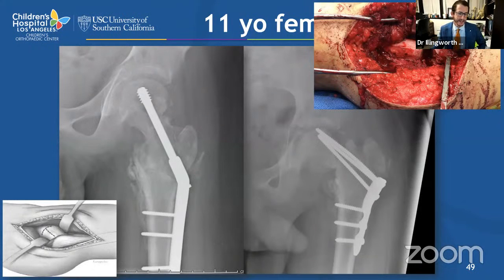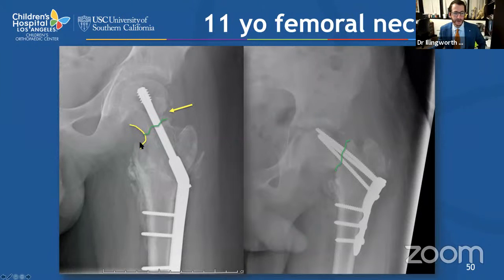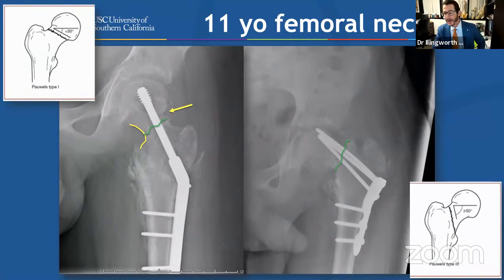You can see that we obtained anatomic reduction along the medial calcar of the neck over here, but certainly where you see the arrow, there were areas of continued comminution and bone loss where we couldn't get a 100% anatomic reduction. But you can appreciate the green line here, where we've essentially taken him from a high Pauwels angle shear force type 3 to a more manageable type 1 Pauwels angle, which optimizes biomechanical forces across that fracture site in order to allow for hopeful healing going forward.